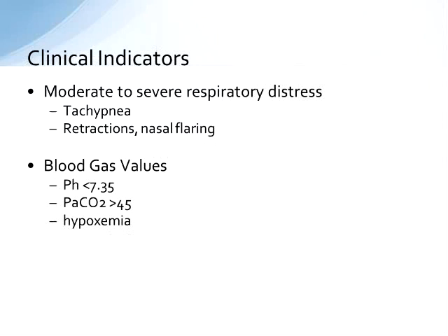I think the flip side to this is if you have a patient that has a pH less than 7.2, I wouldn't even consider wasting time with a non-invasive ventilator. I would go get a laryngoscope and intubate that patient. Those patients often don't recover fast enough non-invasively, so you end up being forced to intubate them. So hopefully you'll be able to facilitate quicker extubation using non-invasive ventilation. So certainly patients in respiratory distress should be considered, but patients that are already in respiratory failure probably should go ahead and be intubated so you don't waste time with futile attempts with non-invasive ventilation.